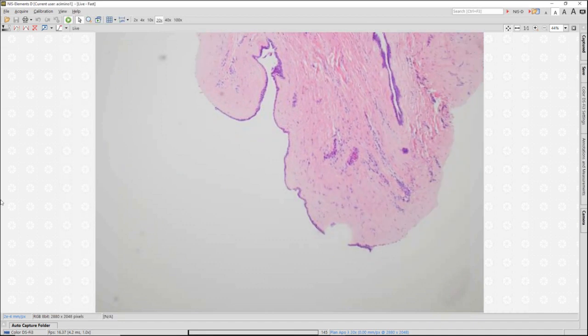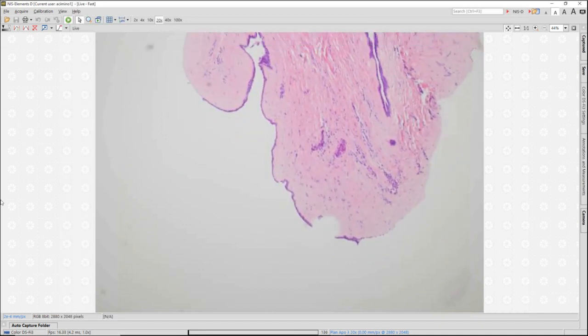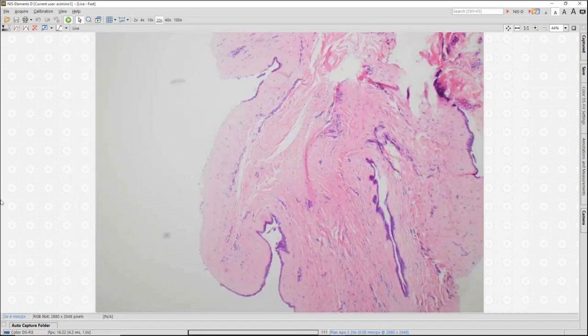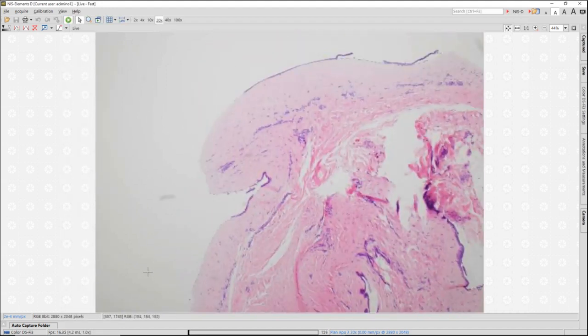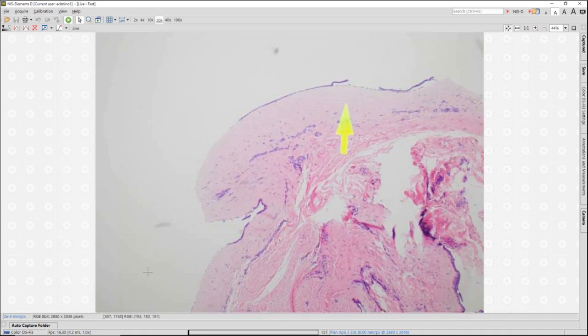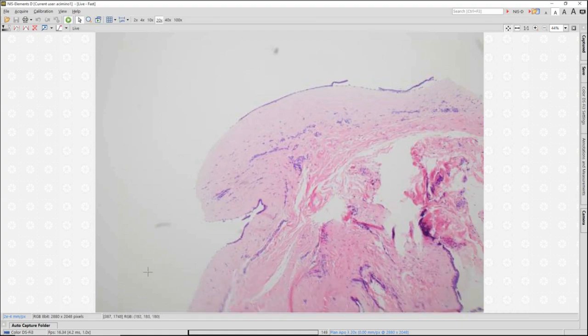In this particular core, we see some of the cores that show just dilated duct wall, if you will, or cyst wall, which you can see here lining at the edge with a bland lining. And it's very common actually to see a thickened fibrotic wall, or capsule, right around the edge of that dilated duct, around the periphery of the papilloma.